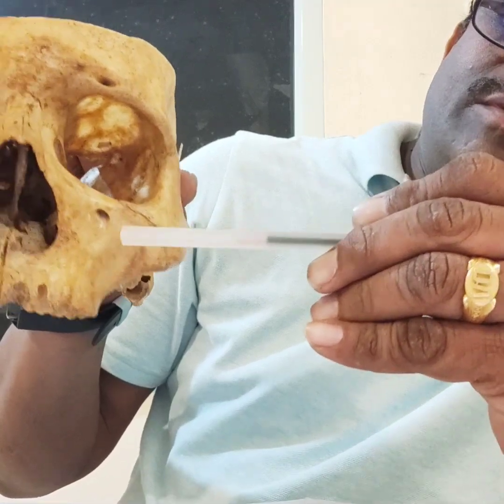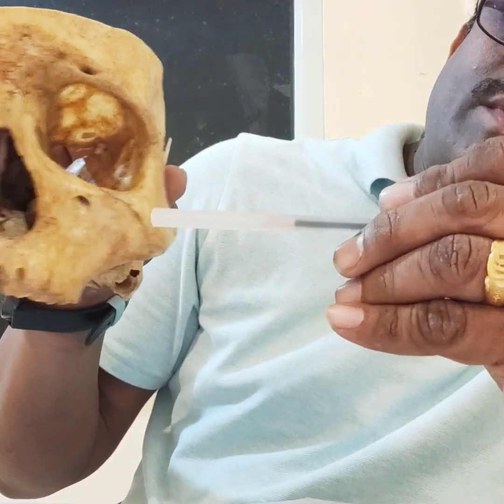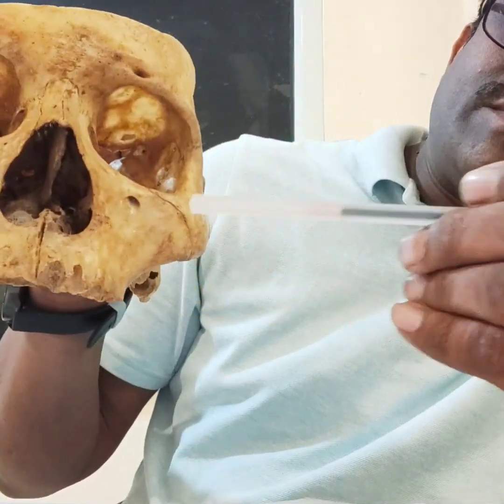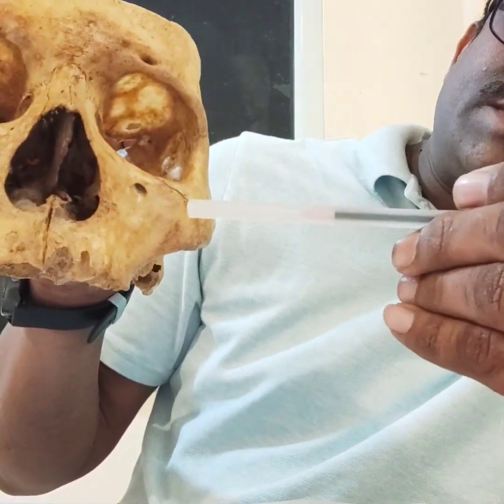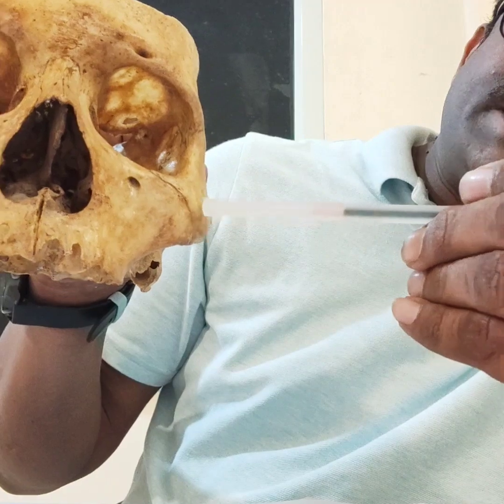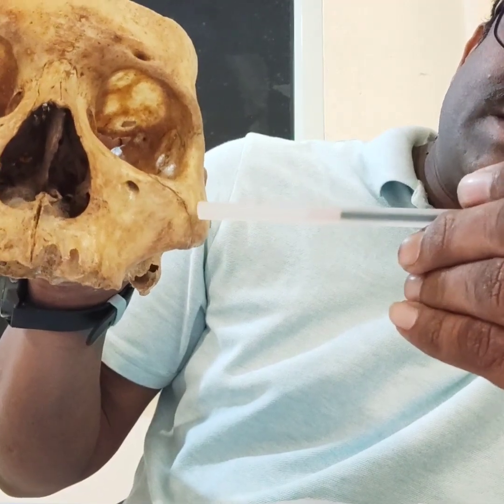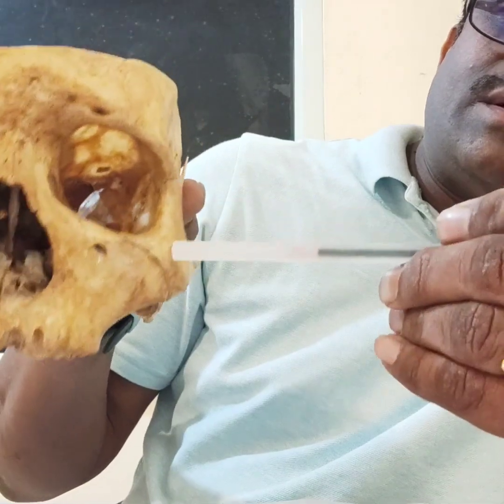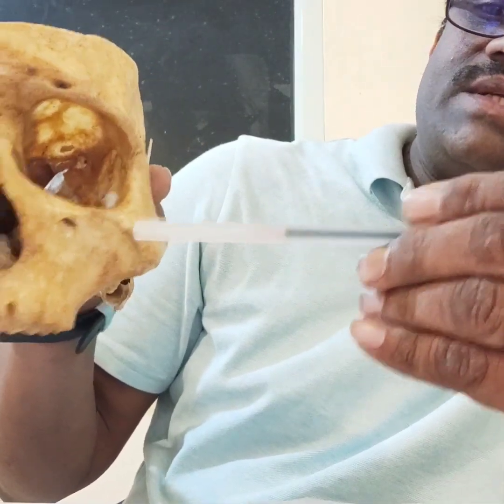Can you see? We sometimes place quad zygoma, meaning 2 zygoma on this side and 2 zygoma on that side, and sometimes triple zygoma, that is 3 zygomatic implants. If there is need of more stabilization, this is the zygomatic buttress.